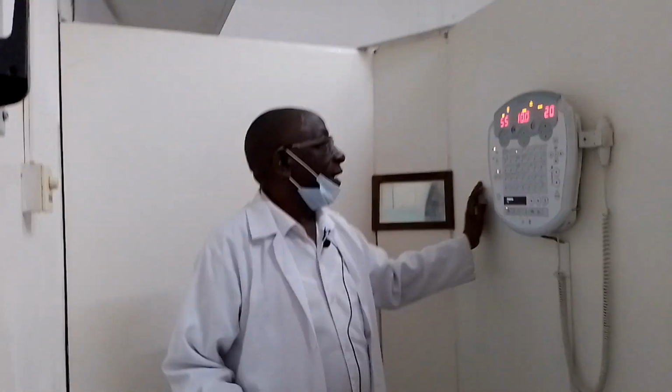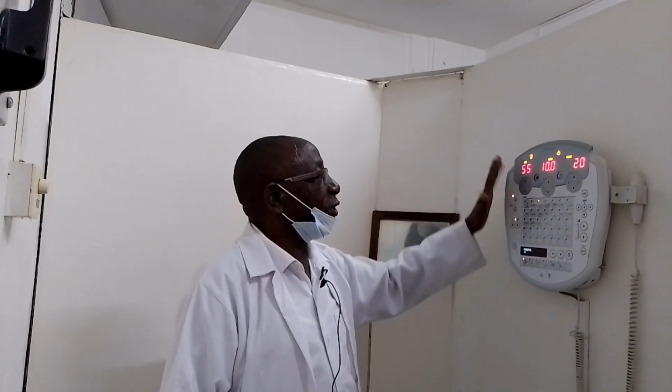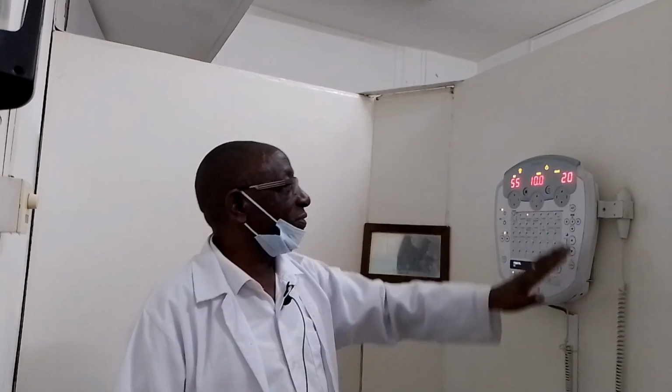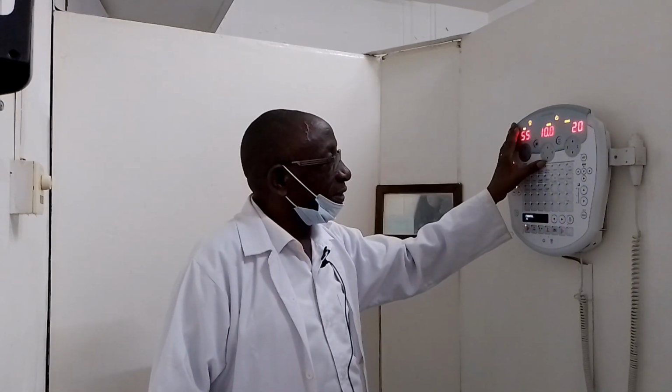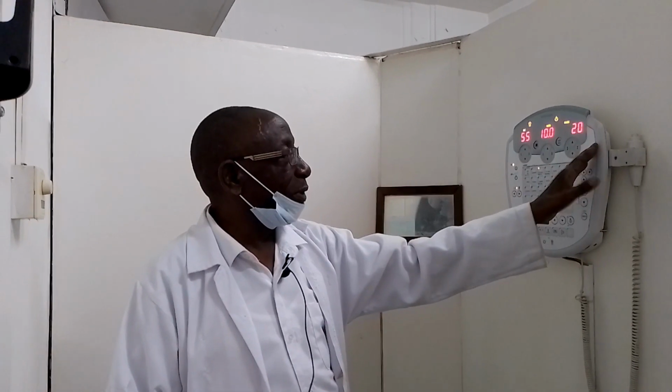Sorry. This is a control room. This one, you have to set your KV, mAs, and time. So if it's for the hand, like this one was for the hand, you set your parameters there. After setting your parameters, you just prepare and then you shoot. And then the operator will take the picture to the computer, and then you are done with that.